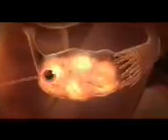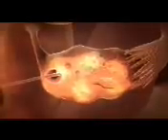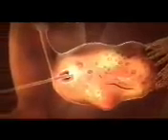Fluid containing the eggs is drawn from the ovary with a needle. This is usually performed under light sedation in a short outpatient procedure, with the doctor using ultrasound to check proceedings.